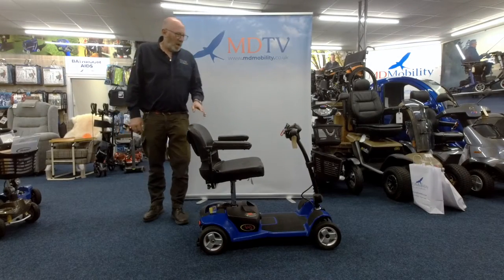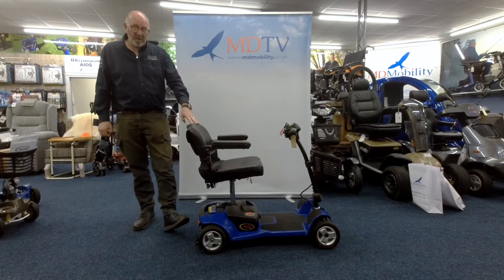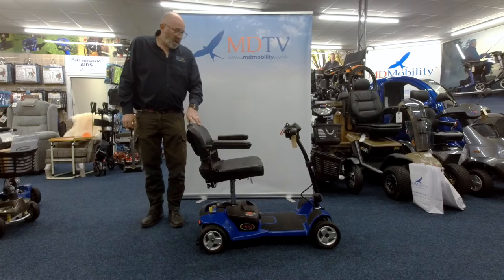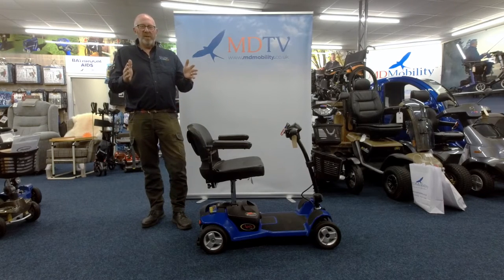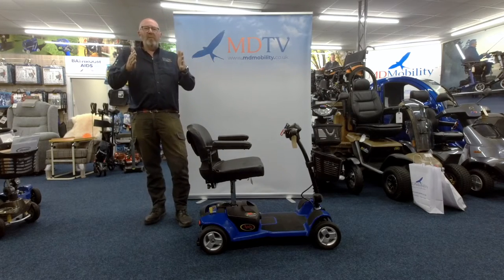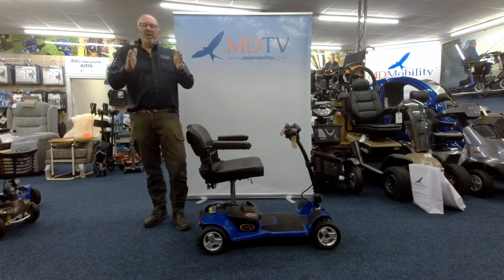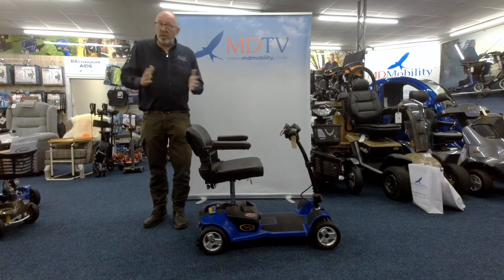Hello again MDTV. I had a couple of ladies in the shop yesterday and they actually bought from us a Pride Apex light scooter. They were asking: is there anywhere on the internet where you can actually see a scooter being taken apart and put back together again, with some helpful tips on how you would place it in the car? So that's what I'm going to do for you this morning.